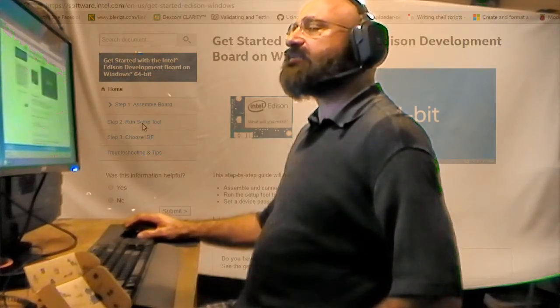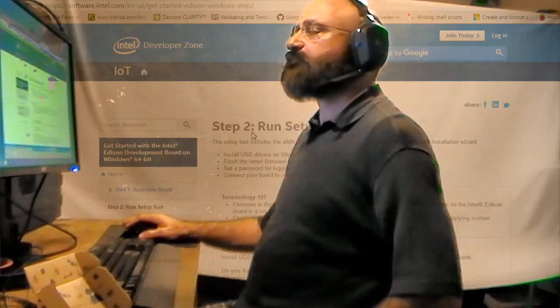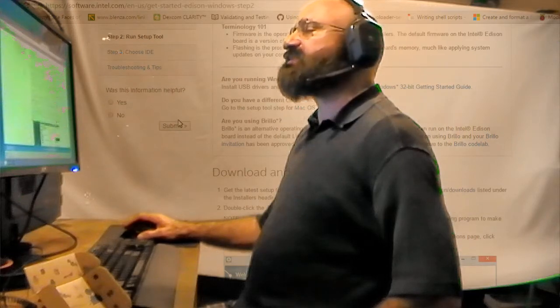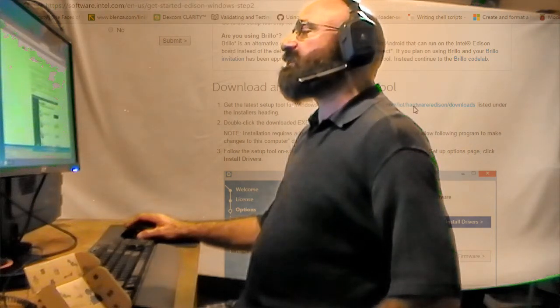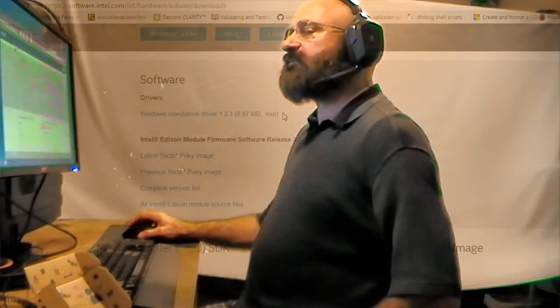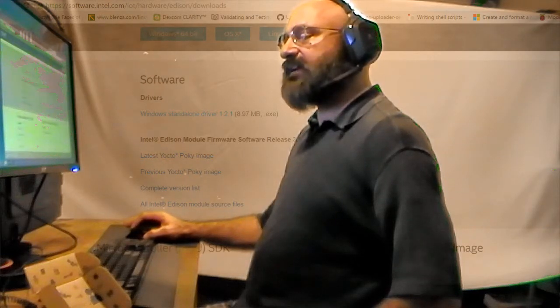Now we need to run the setup tool. This is a Windows setup tool. Let's see. Okay, I guess there's some instructions here, but what we want here is this software.intel.com/iot/hardware/edison/downloads. You can see that up here. We want to come down to this Windows standalone driver. Okay, so I clicked on that and it's downloading.